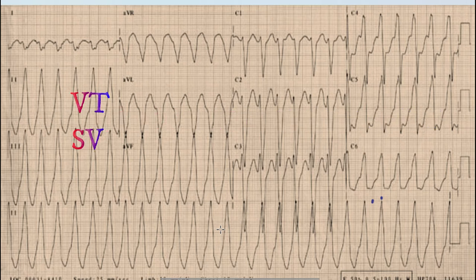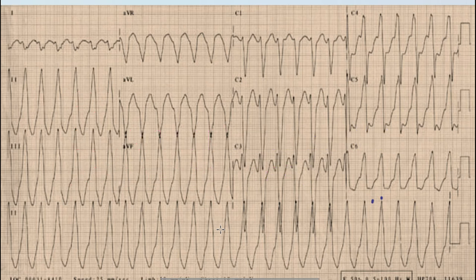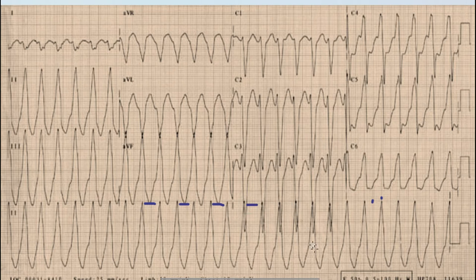A regular broad complex tachycardia means this could be ventricular tachycardia, supraventricular tachycardia with aberrancy, or antidromic SVT. When we look at the RR intervals, they are regular — so we can say this is a regular broad complex tachycardia.